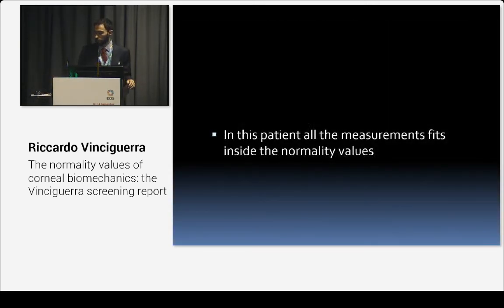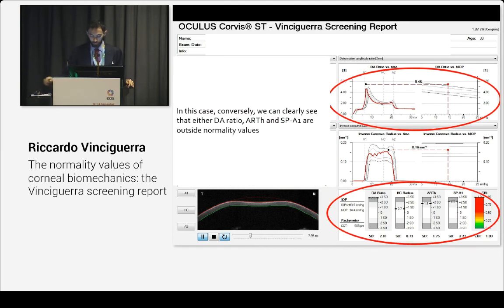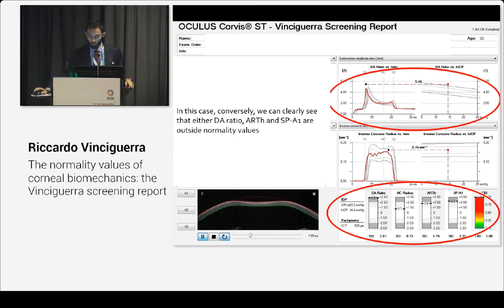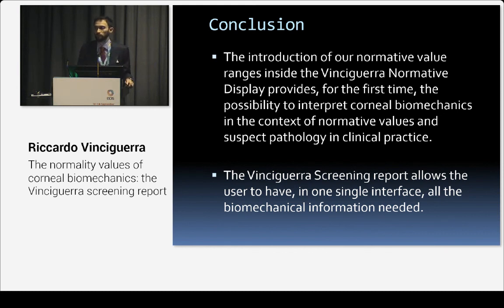The patient was normal for all of these parameters. But let's see an abnormal patient. In this patient, you can clearly see that deformation amplitude ratio and stiffness parameters are outside normality values, all in one display. The introduction of these normative value ranges inside the new Vinci Guerra normative display provides, for the first time, the possibility to interpret corneal biomechanics in the context of normative values and suspect pathology in clinical practice.